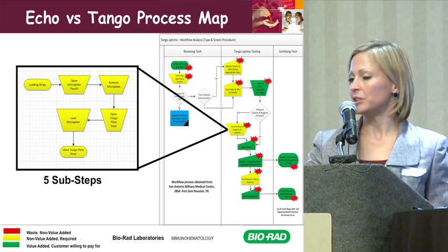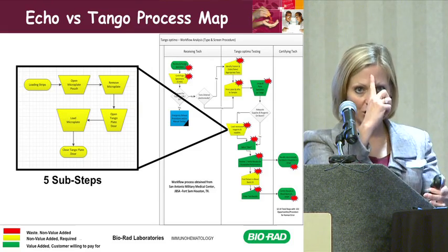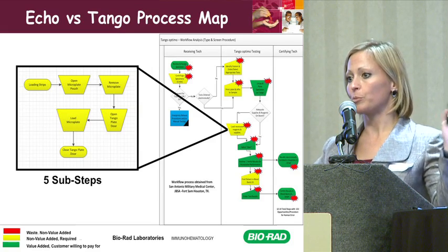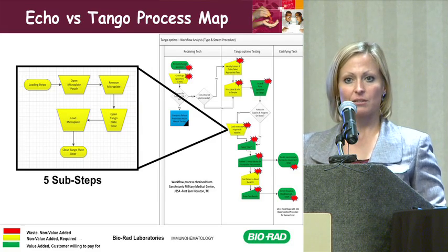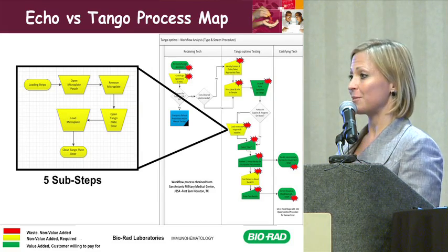When you're loaded with specimens, because there are so many strips on that plate, the actual decision making or the loading from there happens on the analyzer. So it's not your person doing it anymore. So you load it once, and it can be good for a lot longer, many more patients. Does that make sense? Okay. Well, anyway, I was happy there was no red.